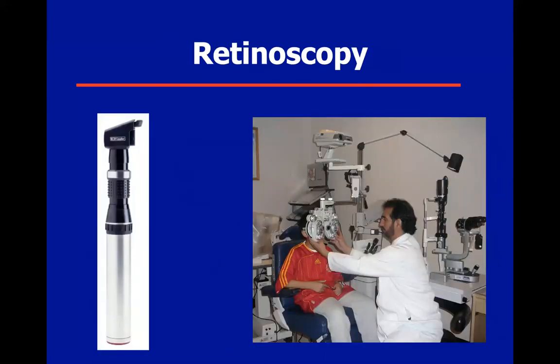So here we are examining a patient with the retinoscope, nothing to do with the retina, simply to understand what his refractive error is and if he needs glasses or not.